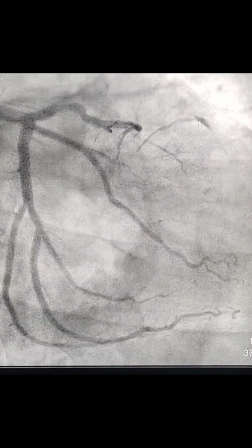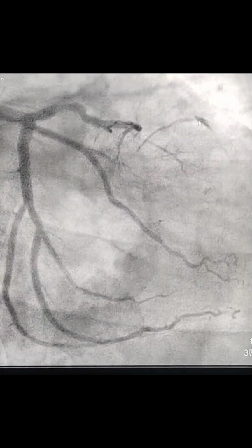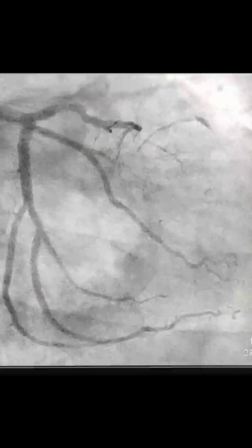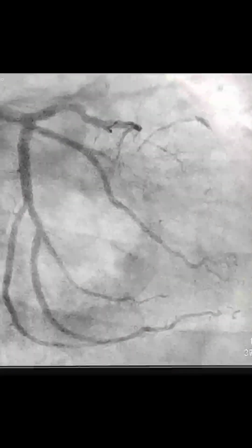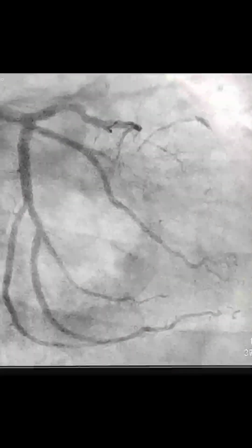And you can clearly see the proximal cap is almost blunted or tapered. It is an unambiguous proximal cap, and the distal vessels you can see, and you don't see any interventional collaterals. So basically the J-CTO score was 1, and we decided to go with antegrade wire escalation techniques to do the angioplasty in this patient.